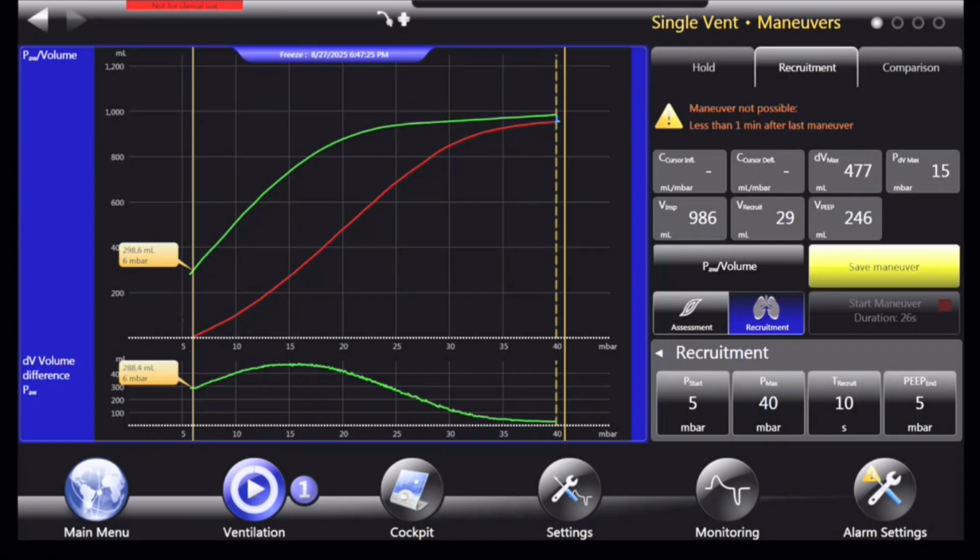We have tried several recruitment maneuvers coming from different ventilator manufacturers. Some have kind of a staircase maneuver. Some are using a sustained inflation or low flow maneuver. So we are counting to this, and over time we will also refine the behavior of alveo. But having a viscoelastic model will allow us to really react to this, and so also put it in the physiology, so that a successful recruitment maneuver will also make some changes in terms of saturation and CO2 elimination on the physiology as well.